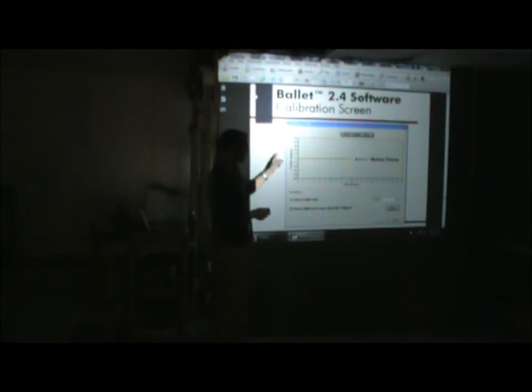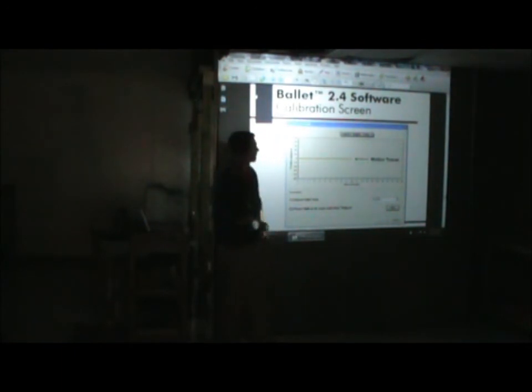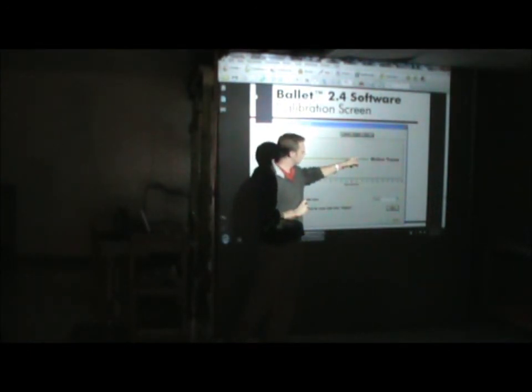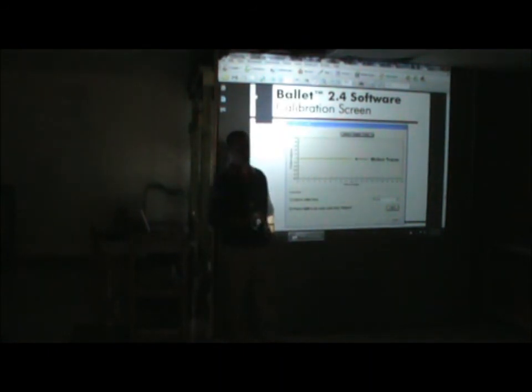This is the screen that comes up once we plug everything in and have it working, and really we want everything to be at 0. For this, you keep the lumbar motion monitor in the case and have it staged vertically. Again, we'll walk through this. If you see that this is squiggly or outside of that 0, you can just hit adjust and it'll zero everything. So it's an electronic calibration.